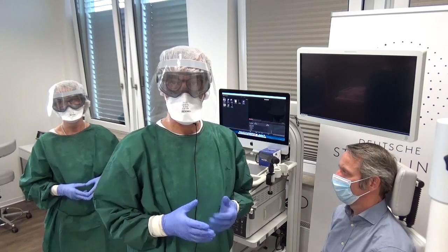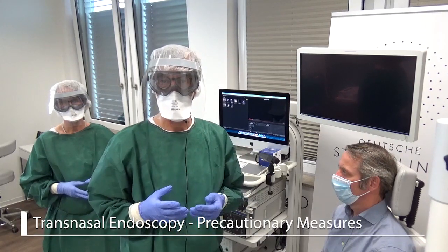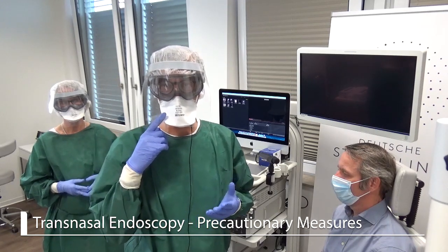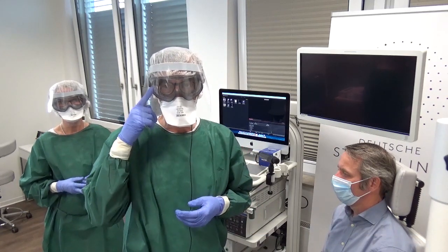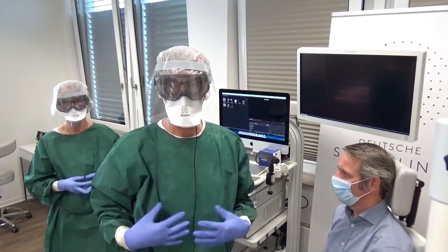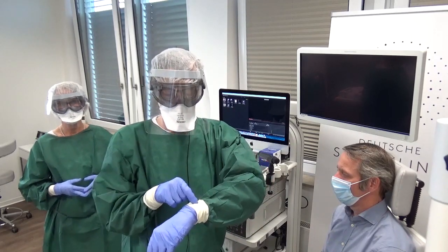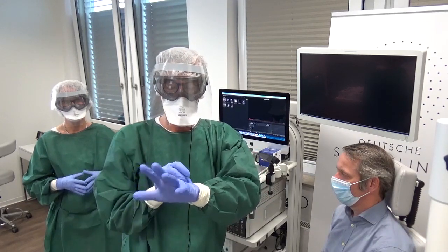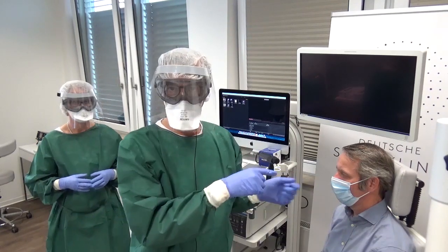Now we're coming to the endoscopy situation, and before I start, I will say how we are prepared. We have an FFP3 mask, but you can also use an FFP2 if you don't have a 3 mask. Then we have the eye protection and we have a visor. We have our hair covered and a single-use gown. We also have two pairs of gloves — this is a snug fit glove and the upper one is one that I will take off after I numb the nose.